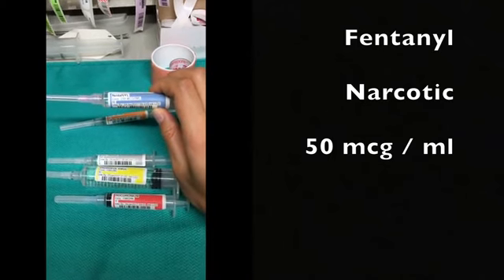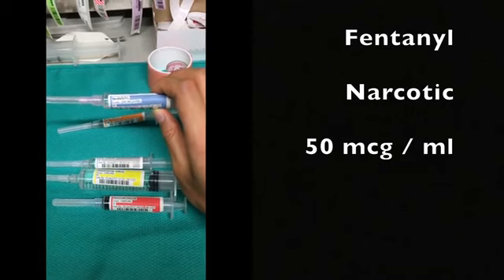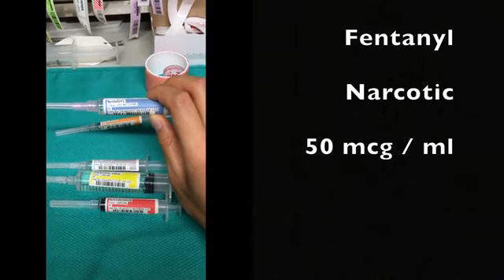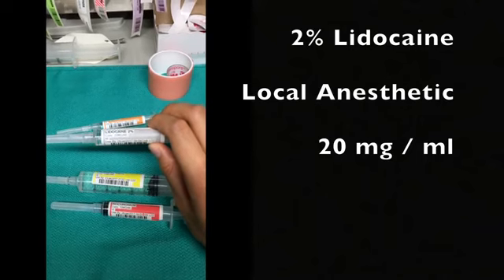Because the surgery and the intubation and the things that they'll be going through during the procedures will be painful, it's always good to give the patient some pain meds at the beginning. So fentanyl comes in a 50 mics per ml concentration. Then we have lidocaine 2%, which is 20 milligrams in ml.